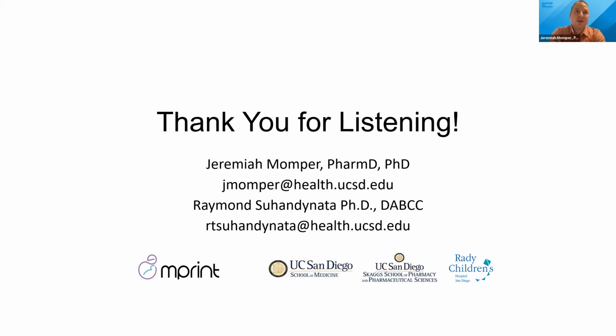A good question. We're not currently treating them as completely different matrices, although they do differ quite a bit in composition. But we tend to have a single method, but then consider more on the back end from an analysis perspective as we analyze data and interpret data. Try to consider those things at that stage, but we're not currently developing unique methods for colostrum, for example.